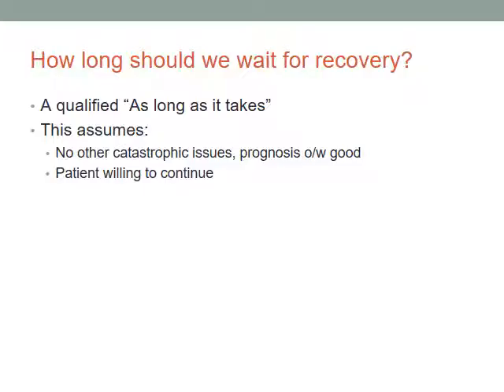They can get better. And it turns out that when you watch, the patient was 115 days. I saw a slide showing that patient's tidal volumes. Nothing happened for over 3 months. There were no tidal volumes. And then suddenly, out of the blue, after about three and a half months, the patient's lungs started working and then started getting volume and gas exchange and got off ECMO. Now, they didn't have normal lungs, they're still badly damaged, but enough to be off ECMO.